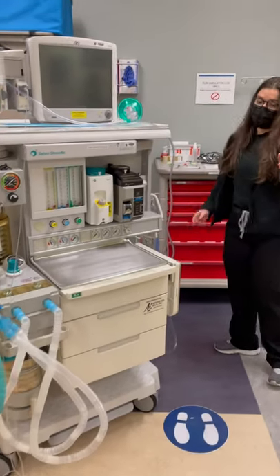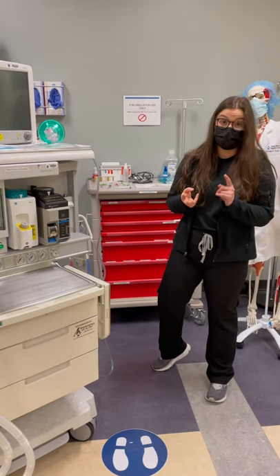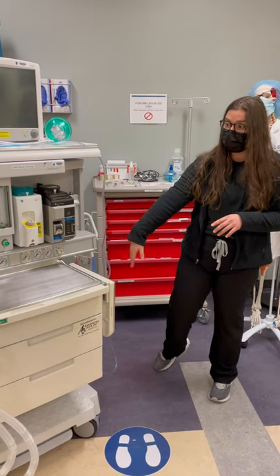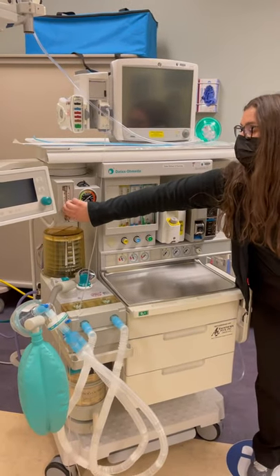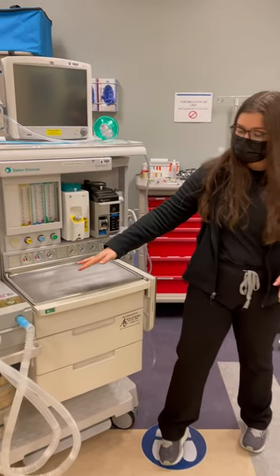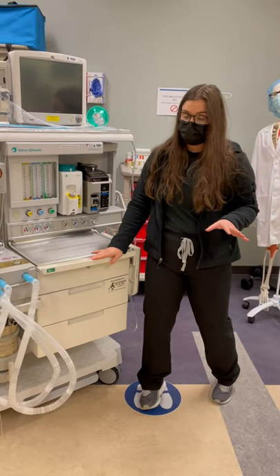Before we do that, we need our malignant hyperthermia cart, our code cart, our airway cart, oxygen or suction at the head of the bed. Make sure your auxiliary oxygen works — we're going to say it does. Ambu bag, flashlight in case the lights go out. These are things that you probably should verbalize and make sure you have.